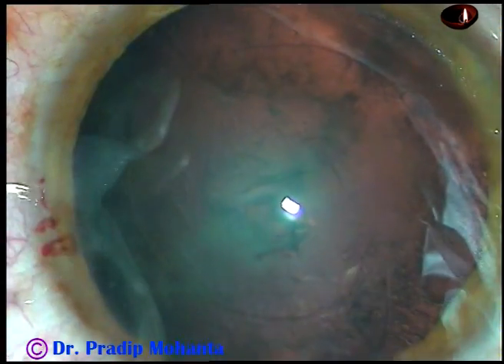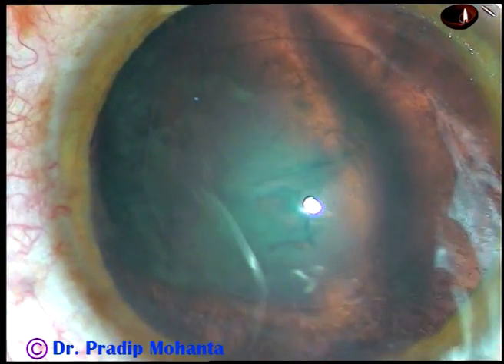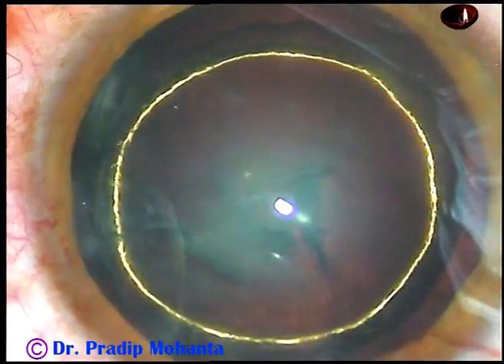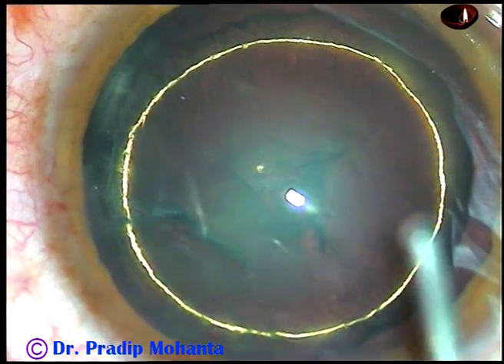The rhexis is completed. Now, hydrodissection: BSS is passed just under the anterior capsular rim and goes to the opposite equator. Hydrodelineation is also done, and it has produced a beautiful golden ring in this case.